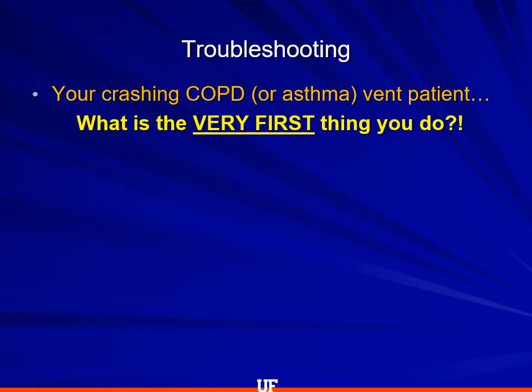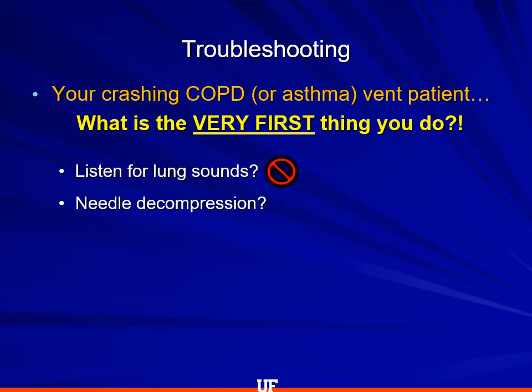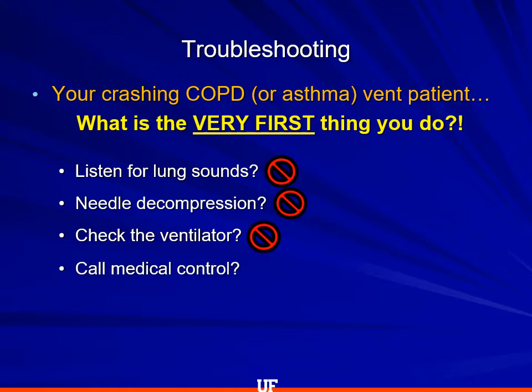What do you do? Do you listen for lung sounds, checking for a tension pneumo? No. Do you needle decompress, just assuming they had a tension pneumo? No. Do you check your vent, see if you've got bad settings? No. Do you call medical control?